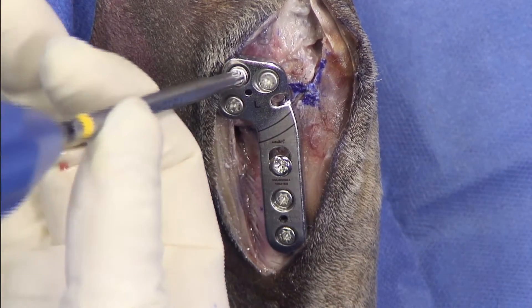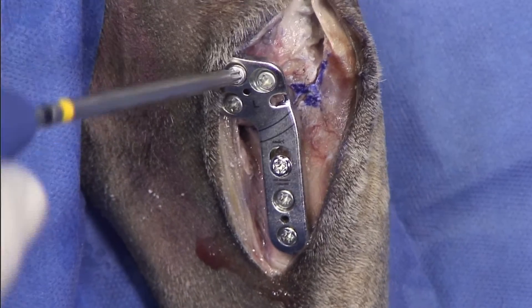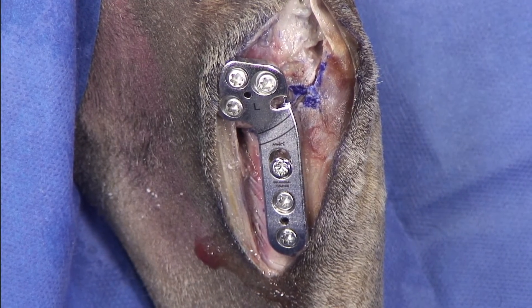We're done and we're going to tighten this screw and check all of the other screws. And the TPLO is completed.